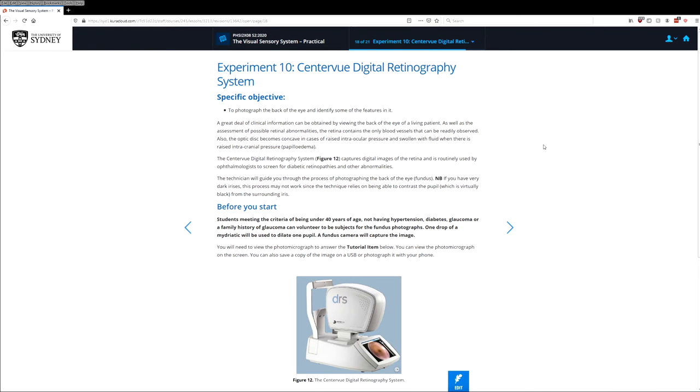In this activity, we're going to be taking photographs of the retina at the back of the eye using the CenterVue digital retinography system. This activity unfortunately can't be done at home since you need a very specialized camera in order to take pictures of the retina.